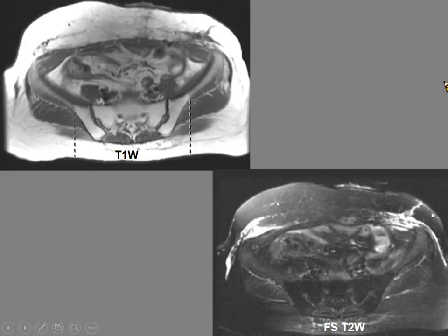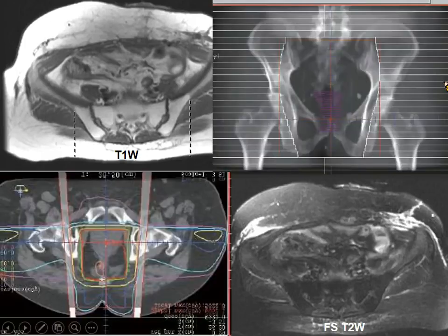Now, why would a patient with a CA rectum get this pattern of marrow depletion? Now, this can be best explained by looking at these images. These are images that are used for radiotherapy planning. On the right-hand side, that's using X-rays, which is what we used to do in the past. And on the left, it's using CT, which is what we tend to do nowadays. But basically, they convey the same message. The area that is exposed to the most radiation is the central aspect, and the periphery of the pelvis is actually shielded from the radiation beam.